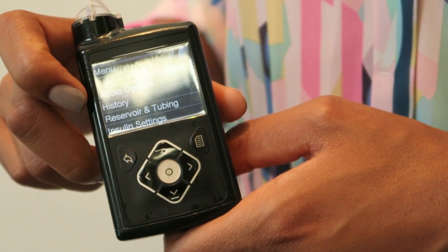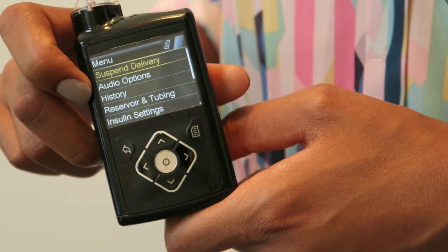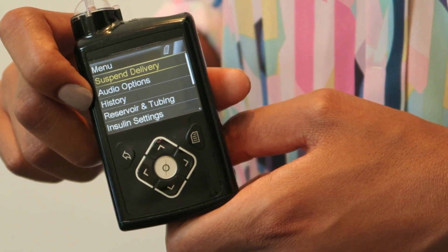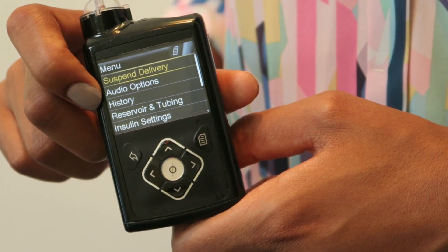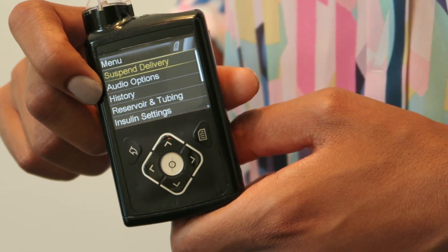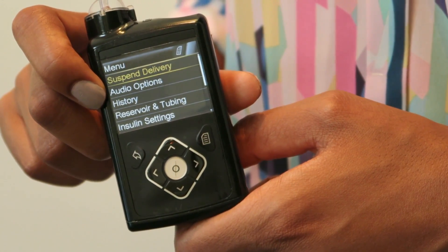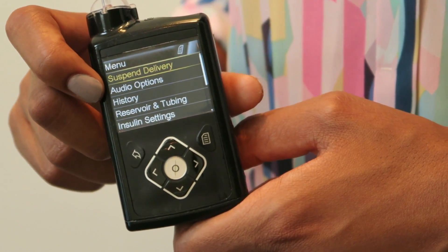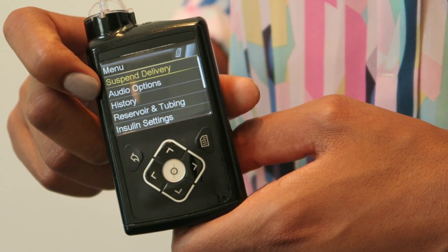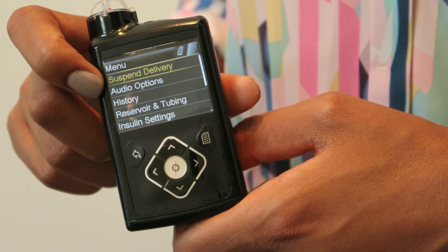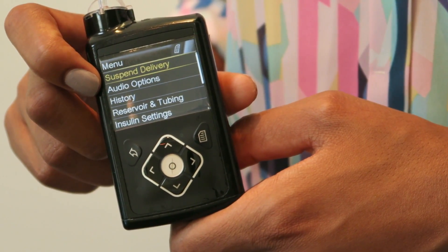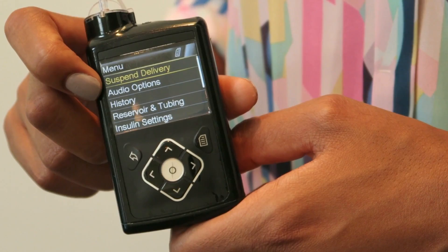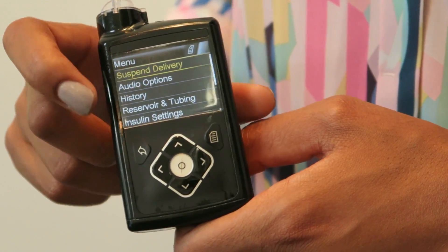You've then got your audio options. Because you're wearing the sensor and you've set parameters for your glucose levels being too low or too high, this option tells you whether you want the pump to make a noise and alert, whether you want it to vibrate, or not to do either at all.